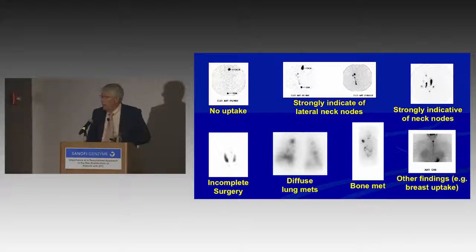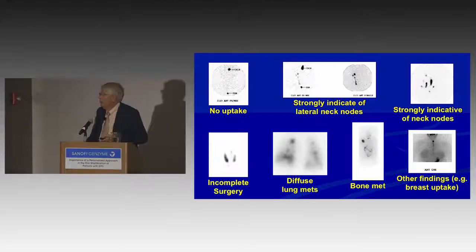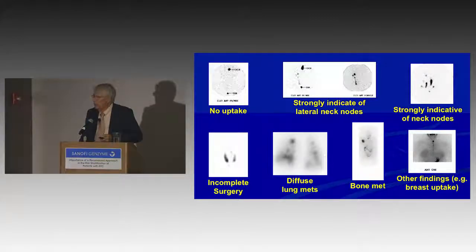In this case, again, the image has 2 markers on the left with a chin marker and a suprasternal marker. They're removed. You have the image on the right that's obtained for a significant amount of time. That pattern suggests lateral disease to me. It doesn't take a nuke med or a rocket scientist, I don't think, to convince you all that would raise local regional disease in the lateral neck. Another one, just as I showed 2 cases, multiple foci, more than a surgeon leaves behind, strongly indicative.